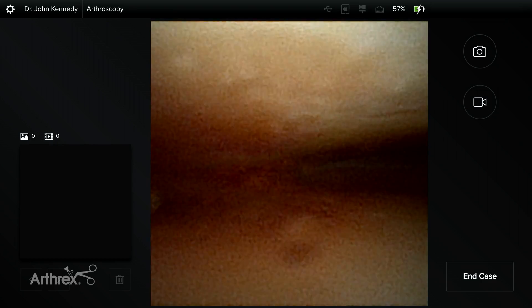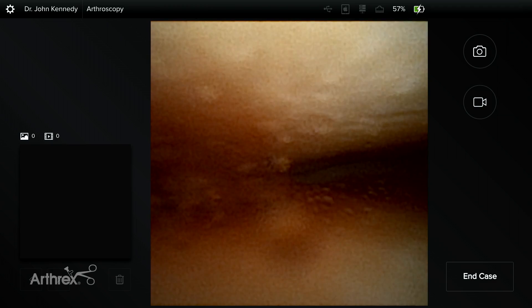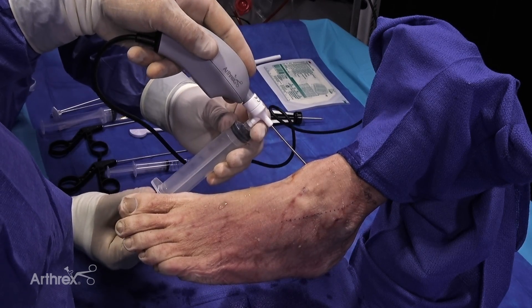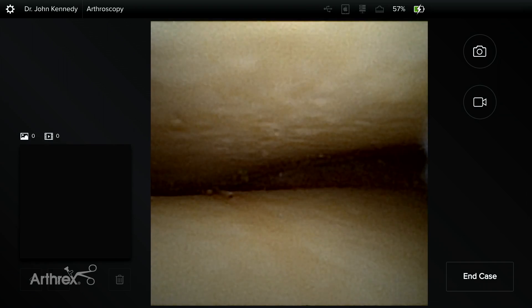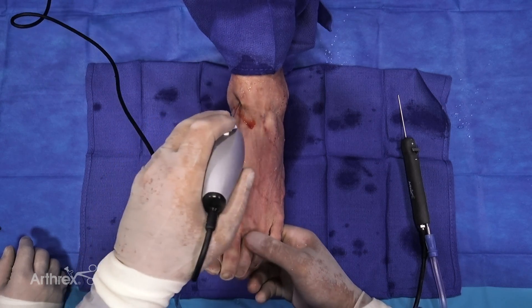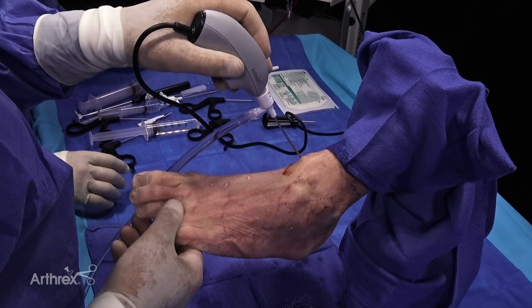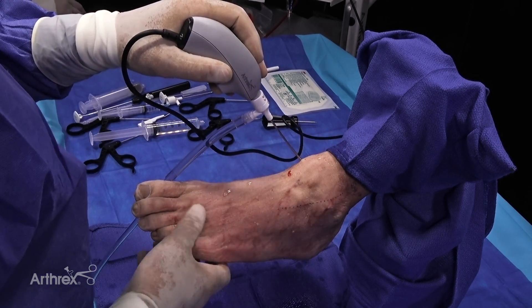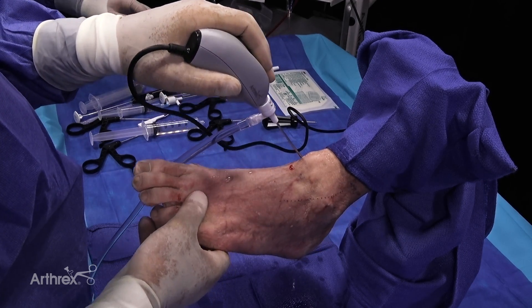Another way we can do this is to clamp off the pump and use a small syringe — and you can see that it's clearing up the image very nicely. As we articulate, there's a small little defect here, most likely traumatic in origin from an ankle sprain. That fibrillated cartilage over time will not regenerate. This is an area where we can identify pathology very early on with the use of a nanoscope, and we could deliver a biologic very easily here in an effort to protect the underlying cartilage. This is not something you're necessarily going to see on MRI or other conventional imaging — and this is when nano really comes into its own.